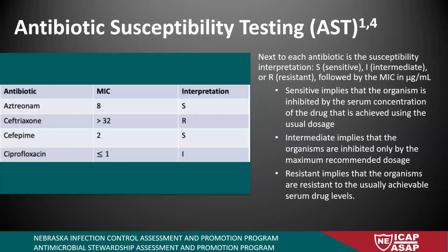Here is what a carbapenemase producing CRE culture could look like. On the first example, you can see that it says carbapenemase detected on the top. That's a big one. Then it has a star. If anything ever has a star by it, make sure you're like, yeah, that's important. We want to know that's important. And if they say results reported to the state health department, that's also probably important. That means they called me about it, and that means I probably called you already. But anyway, that's something to look at for sure.